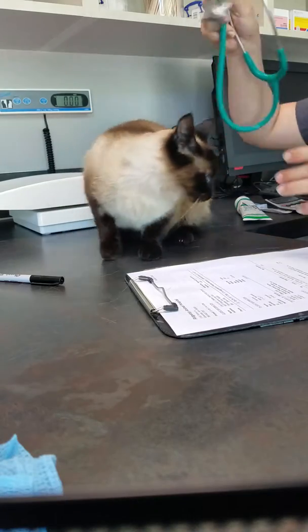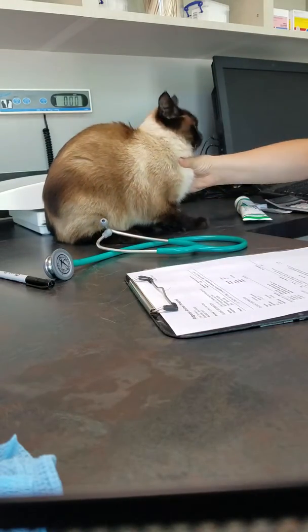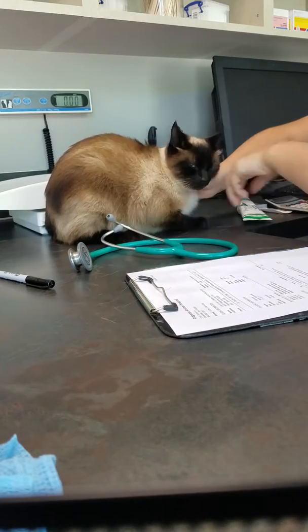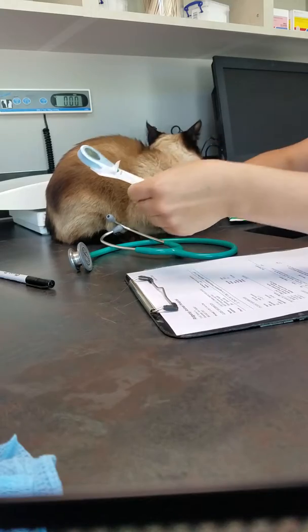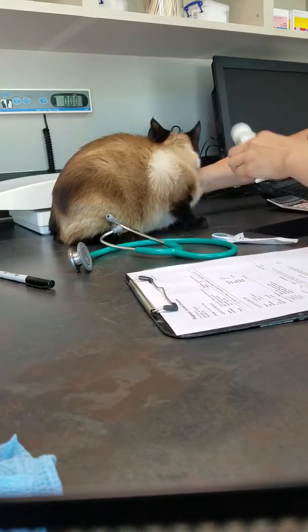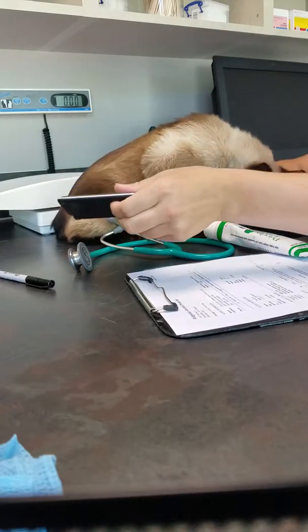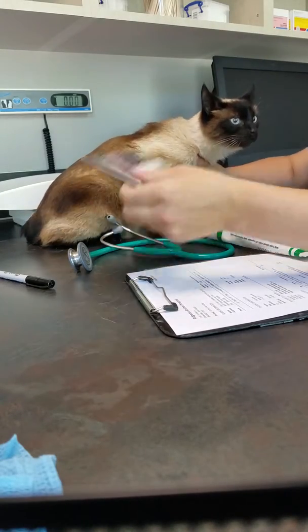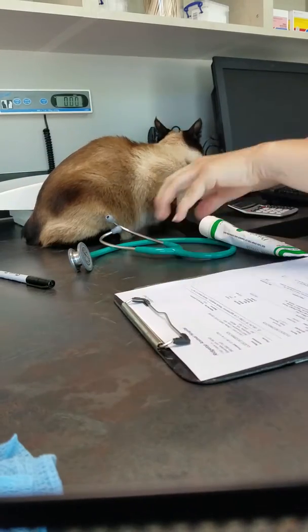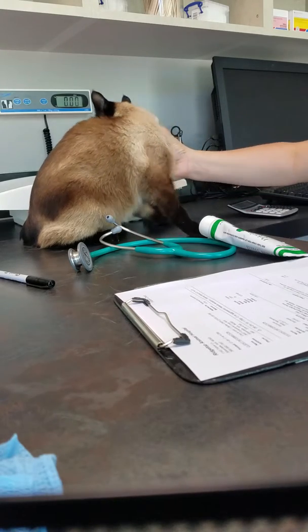So I have a stethoscope right here for that. Let me show you my tray of supplies too. I have a stethoscope for listening to the heart and the lungs. I have a thermometer here with a new probe cover for taking the temp. I have a loop for the thermometer cover. I have a calculator for calculating my heart rate and respiratory rate. And then I have the patient's chart right here with me. And then I have a scale too to weigh the patient as well.